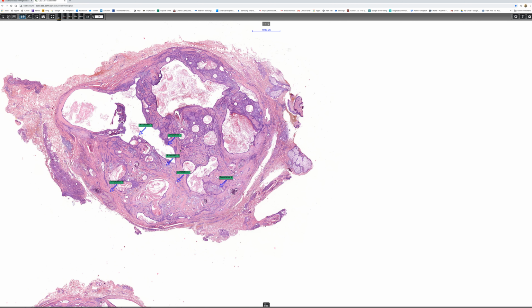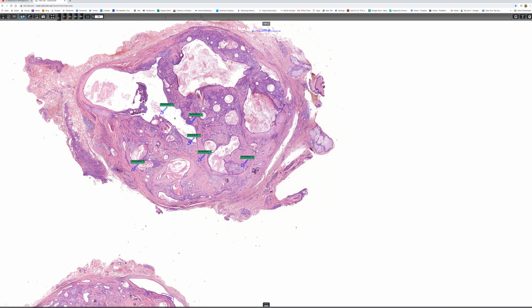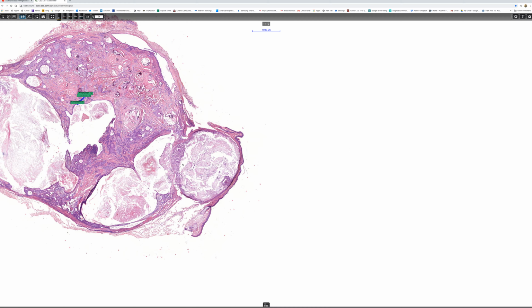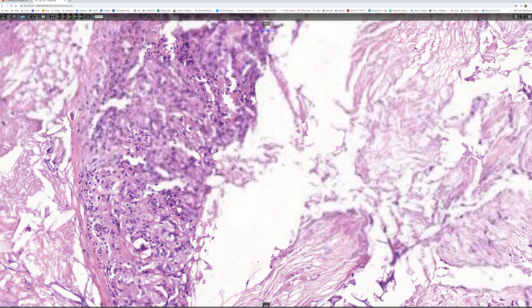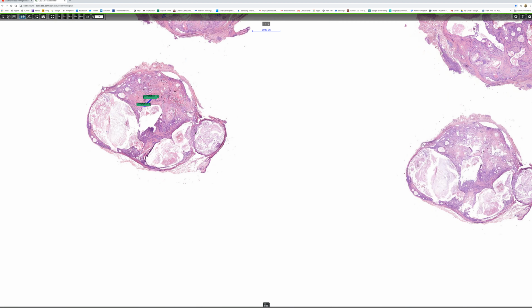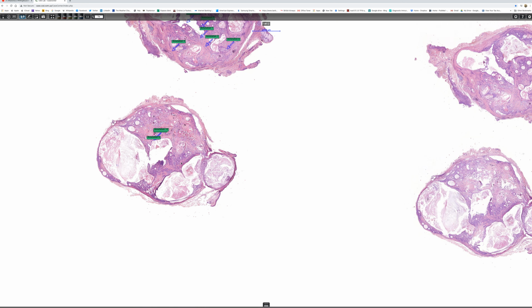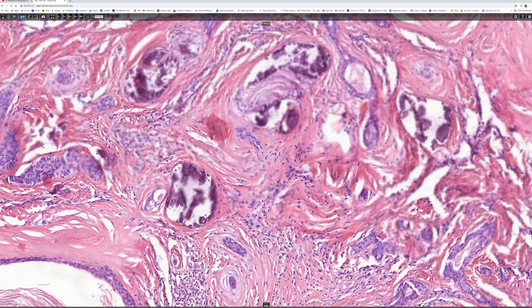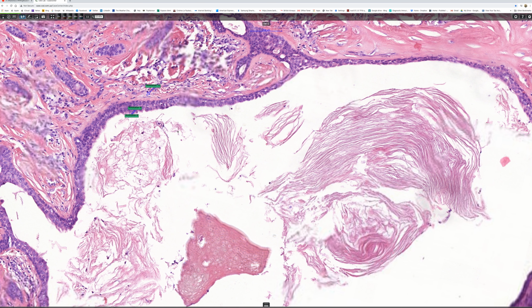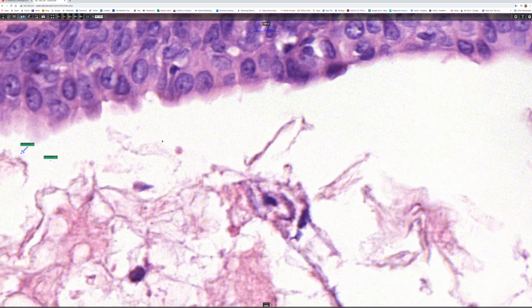And this one has very marked cystic change. Some of the cysts contain keratin, and I think in this one, it almost looks like multiple epidermoid cysts, which in places have ruptured, giving rise to a histiocytic and giant cell reaction. And so that's a little feature that is a bonus. And also this one shows very marked calcification. And then this bit's nice, because here this is glandular differentiation, and it's apocrine, because there are very well formed apocrine snouts, which are really very nice.